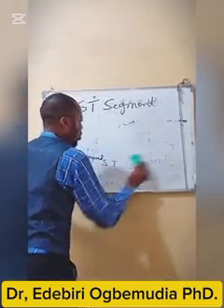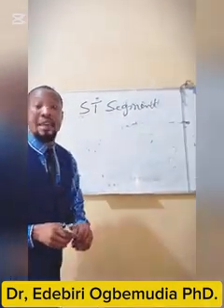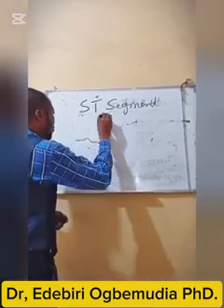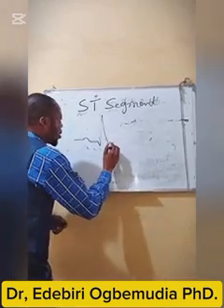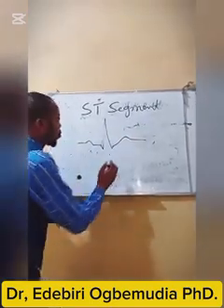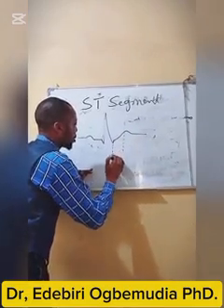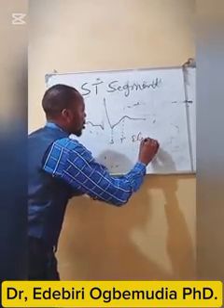I'll remove this and draw another ST segment that is elevated. You can see the S, so from here to here, this S, this T. ST segment elevation.